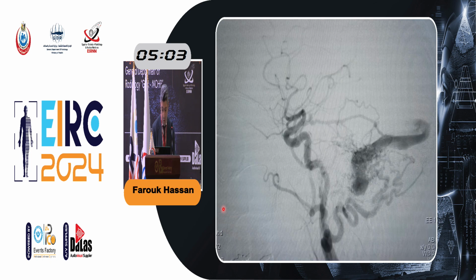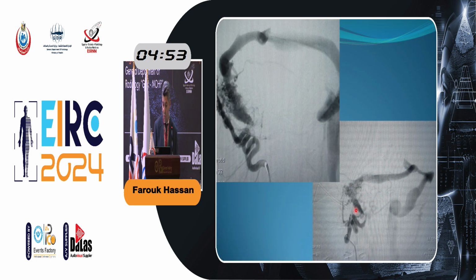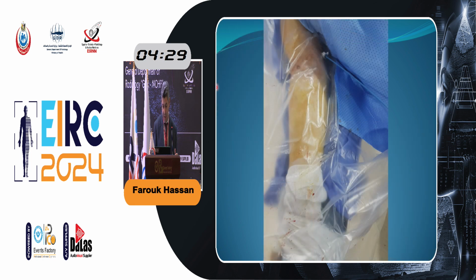So here it's easier to go from the contralateral side. This is a sinus also. We can see the site of the fistula, so we are going to occlude all this part of the sinus. It's very important to study the hemodynamics of the flow of the veins in the delayed phase to make sure where the vein of Labbé, for example, will be going, and the vein of Labbé will be continuing to drain into the sinus, maybe to the contralateral side. So we have to avoid having Onyx refluxing to the point of the vein of Labbé. This is the site of the fistula, so we are going to occlude this part of the sigmoid sinus.